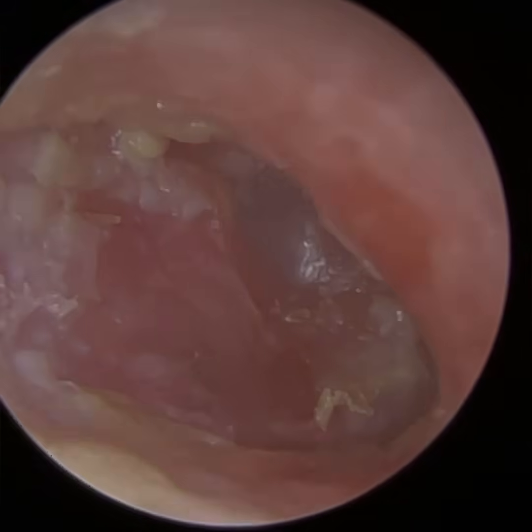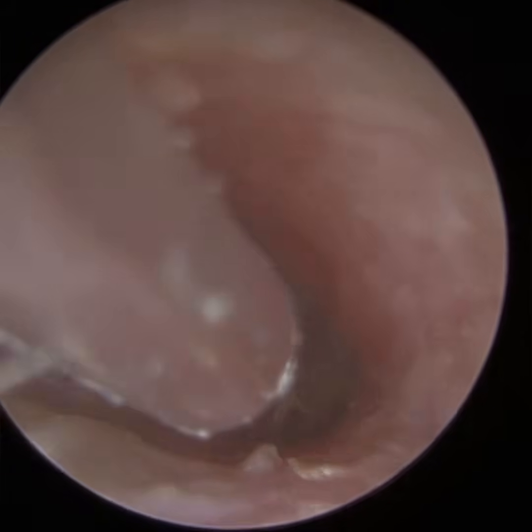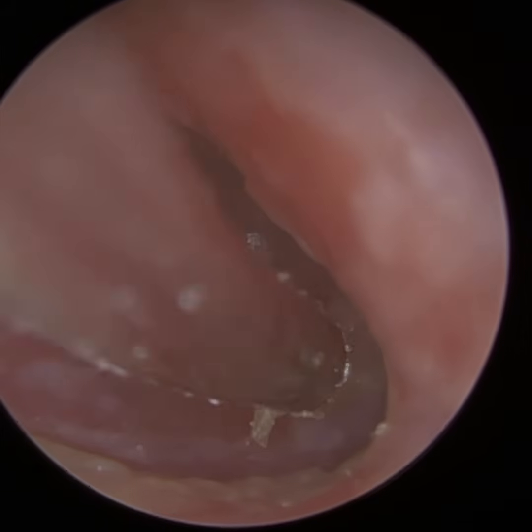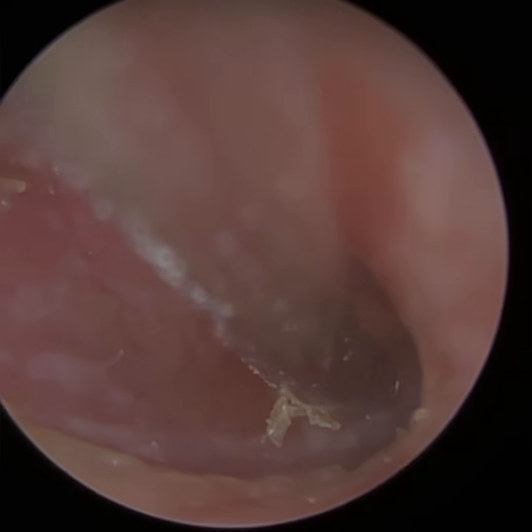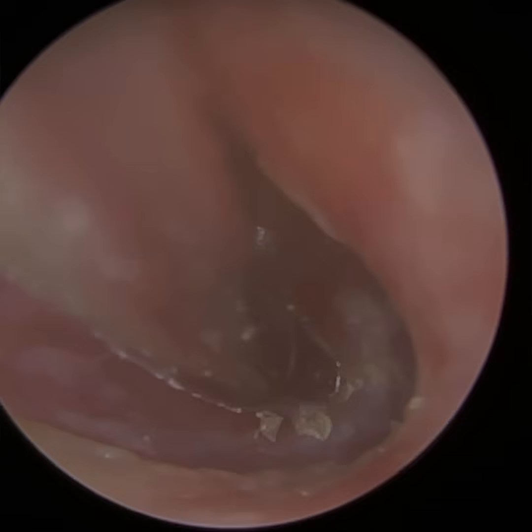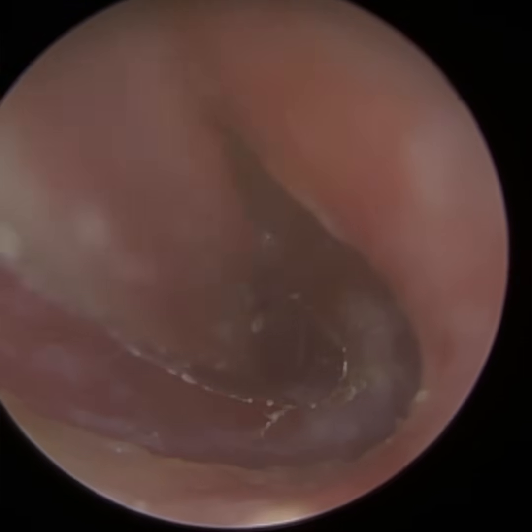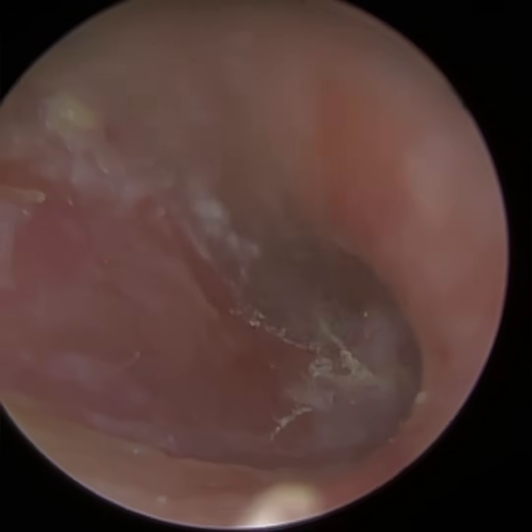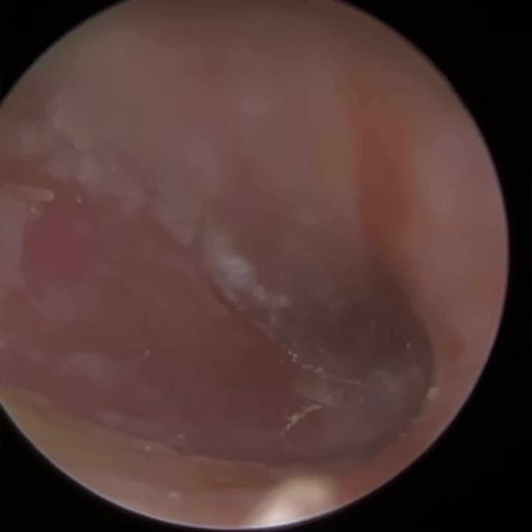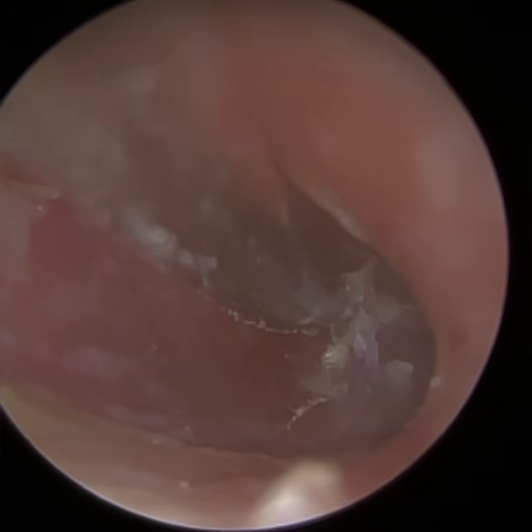This patient's ear canal is a bit longer than the average ear canal length. So the average ear canal length from the entrance to the eardrum is approximately 26 millimeters, but that can vary, of course. Children, it's going to be shorter. Male ear canals are longer. And there's individual differences between males and females. So I would say this is a bit long, probably, I'm not 100% sure, but more approaching 30 millimeters. So it's a bit difficult to get access, and you can see how I've just curled the tip of this fine end.